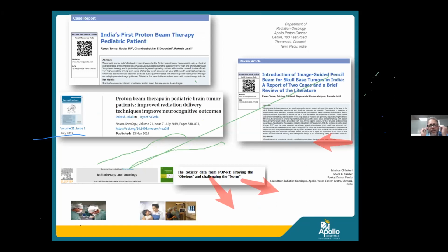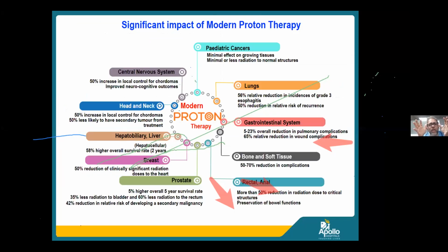And finally, this is, I think, my final slide, as a summary slide, I can say, while proton is not unequivocally proven, we believe this is a significant advance in different clinical sites. It does have some amount of uncertainty you have to be careful about. There is a great deal of excitement and collaboration in different parts of the world using this technology. A number of clinical trials, in fact, I believe that it is even as equal or maybe more in some sites as compared to the photon, where proton therapy in different platforms is being studied.